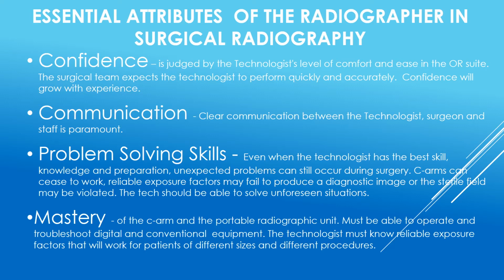Mastery of the C-arm and the portable radiography unit. Must be able to operate and troubleshoot digital and conventional equipment. The technologist must know reliable exposure factors that will work for patients of different sizes and different procedures.